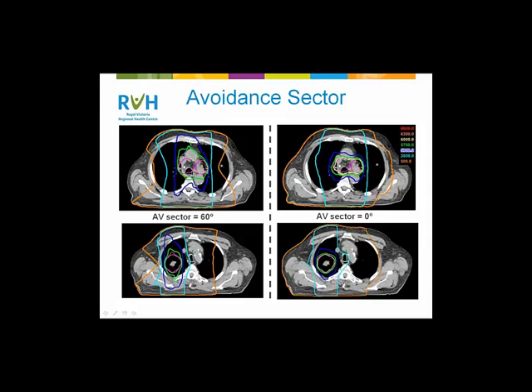We had a very experienced dosimetrist from the Odette Cancer Center at Sunnybrook, and she came up and spent a couple of days looking at this technique, going through different scenarios of weighting. Her conclusion, independent from us, was that the weighting we have and that I presented seems to work the best in general. So that was a nice confirmation. Heterogeneity, yes, it is always on.